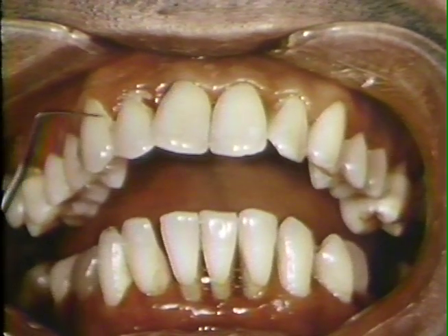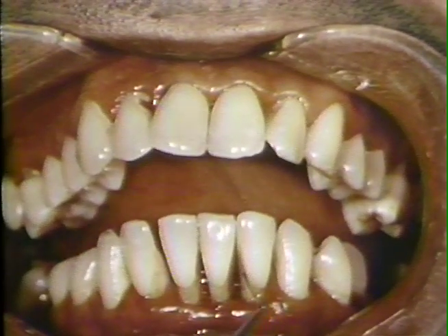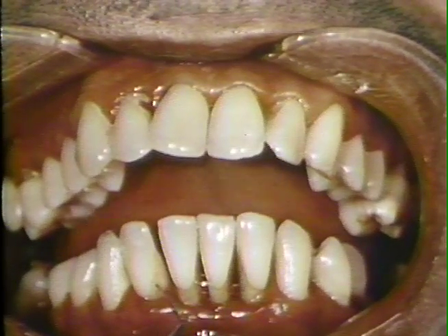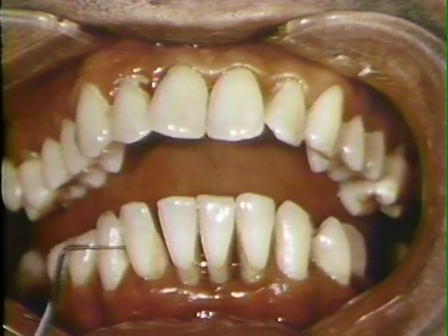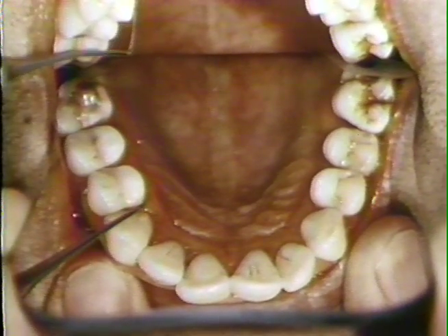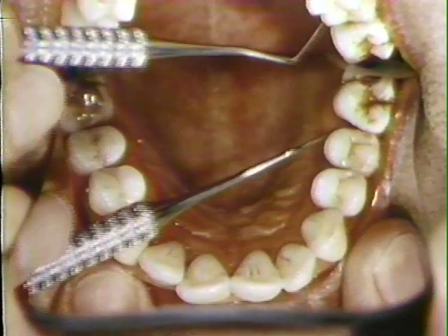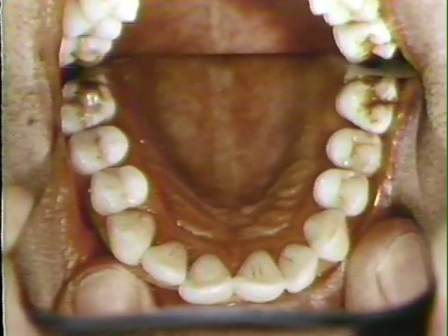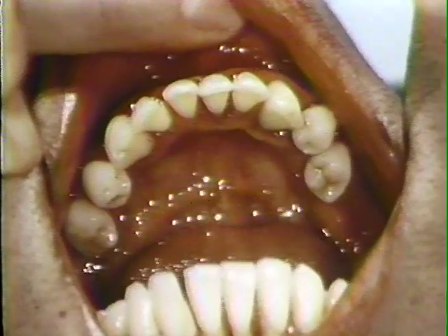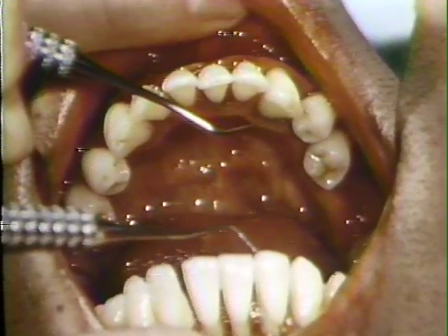After the patient has rinsed his mouth with water, it is evident that the root surfaces have absorbed or retained some stain from the disclosing solution, indicating the need for additional polishing. The patient is also instructed in detailed home care procedures. This, however, is the subject of a separate film and will not be demonstrated at this time. The lingual and palatal surfaces, as well as the labial and buccal surfaces of the teeth, are carefully checked for residual stain.